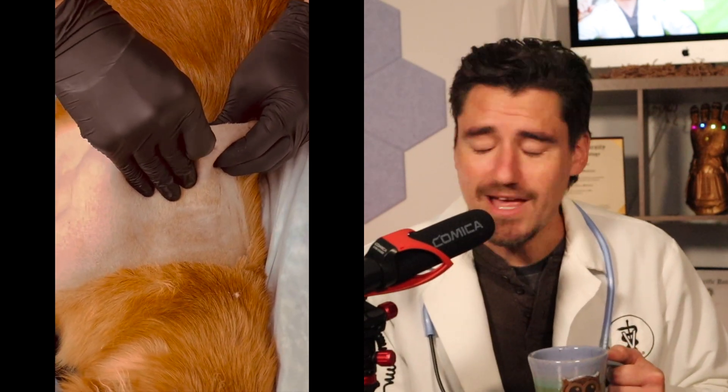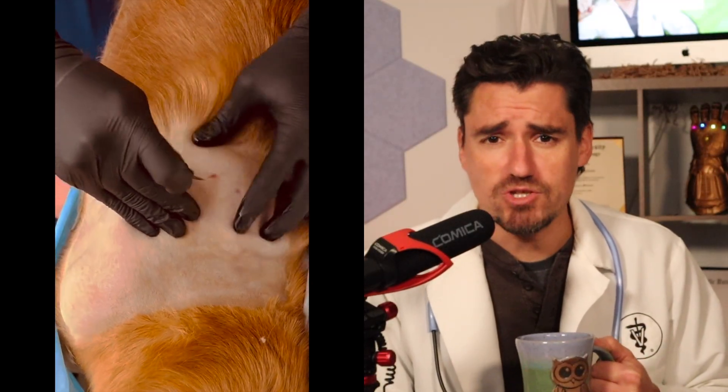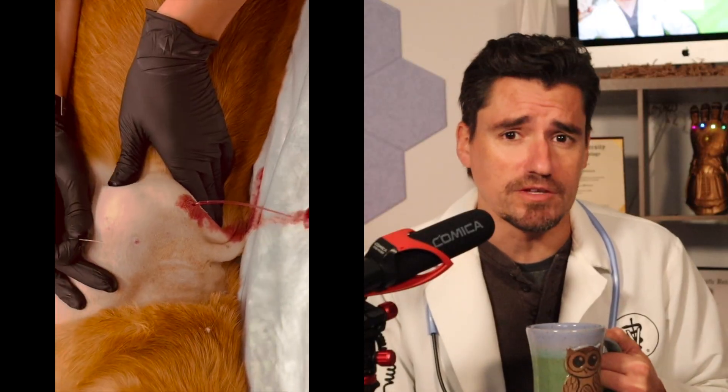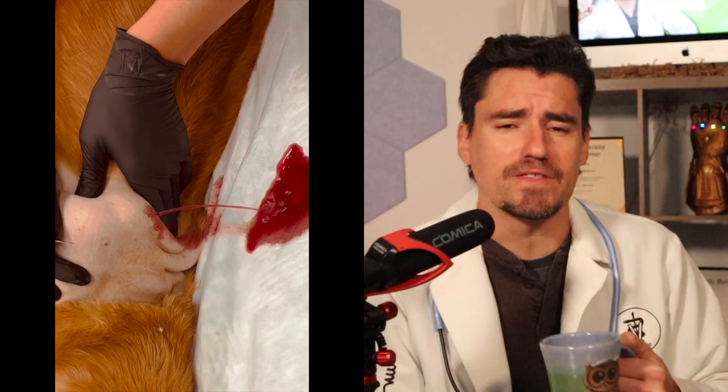You're going to notice it's a little bit red in color. That's okay — it's serosanguinous. There is infection in there; we put this under the microscope and it showed a lot of bacteria or cocci, and it also showed a bunch of white blood cells or neutrophils that had gobbled up or phagocytosed the infection.